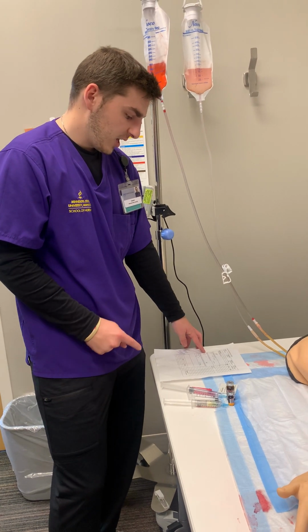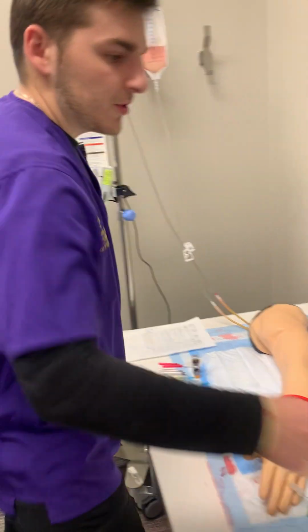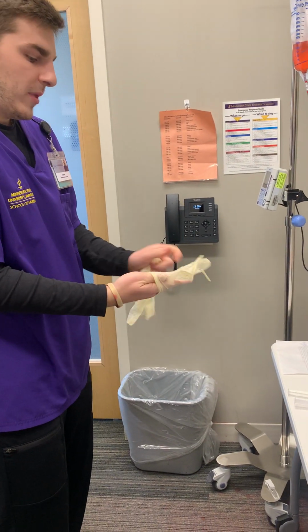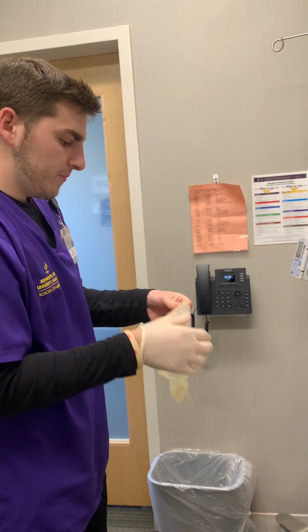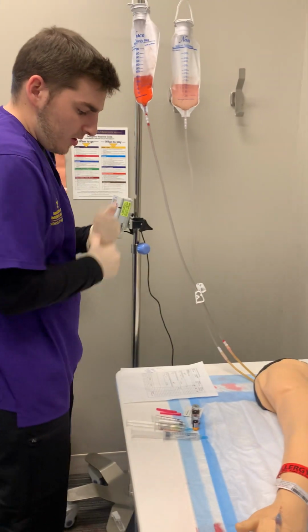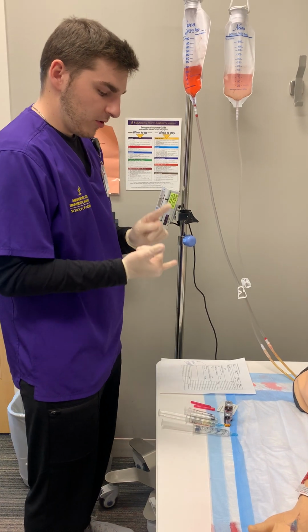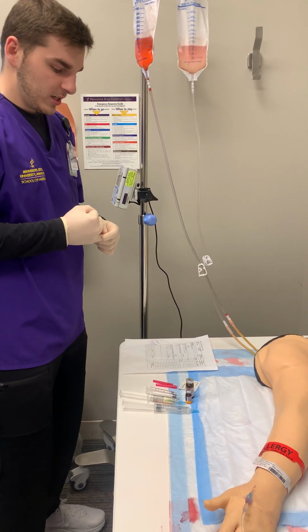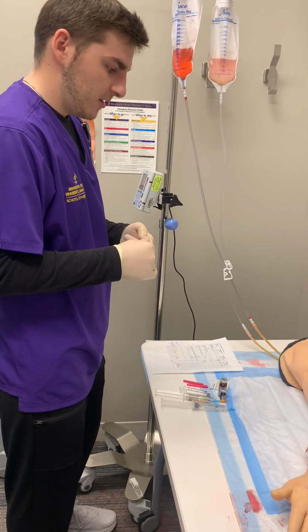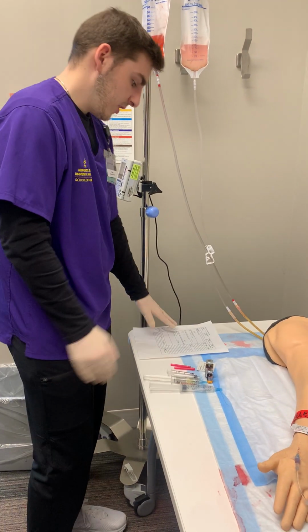And ketorolac will actually help with your pain as well. So we'll draw that up for you, okay? So I'm just going to grab some gloves here. And I'm going to just draw my medications quick, okay? Alright, so while I'm drawing up my medications, I'm doing my first medication check against the MAR. So I'm looking for right patient, right medication, right dose, right route, right time, right reason, right to refuse, and right allergies. So like we saw, allergies, that's why we can't give hydromorphone.